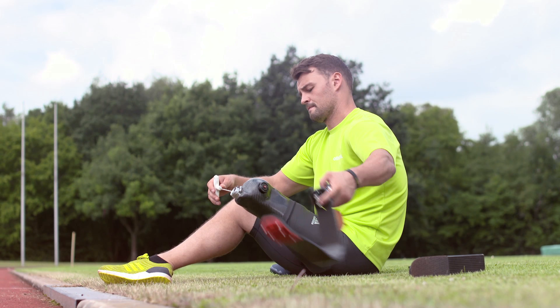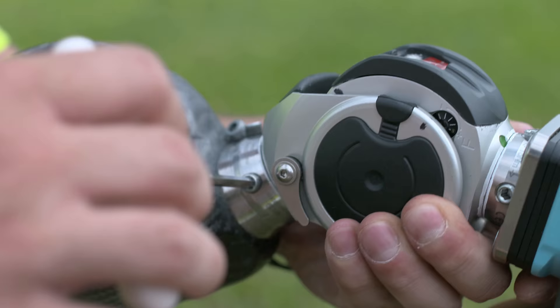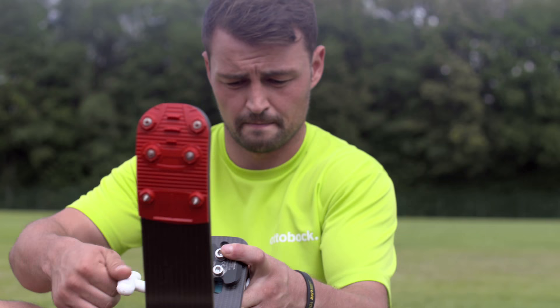As an above-the-knee amputee, Popov also requires a hydraulic knee joint and a custom-made socket, which is individually molded as an exact fit for his leg.